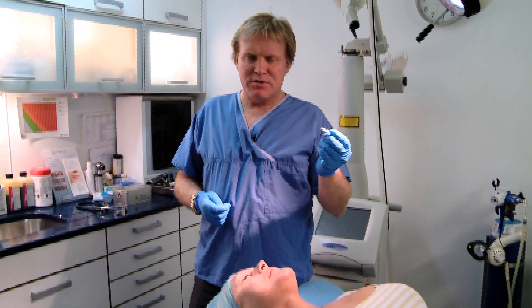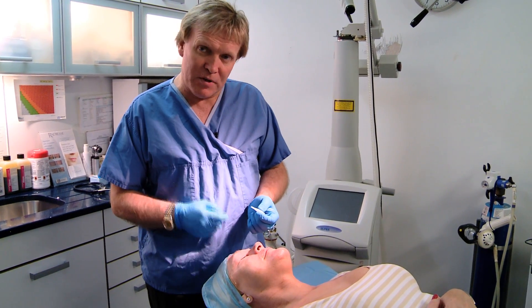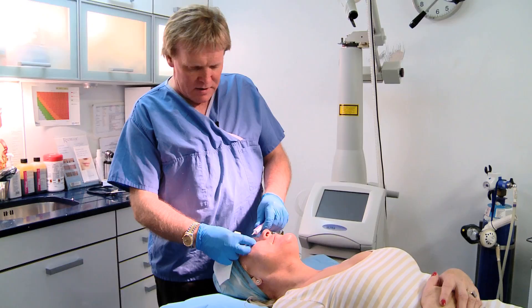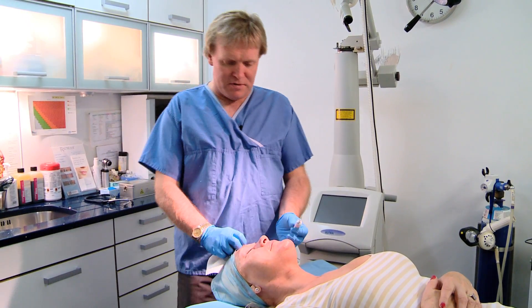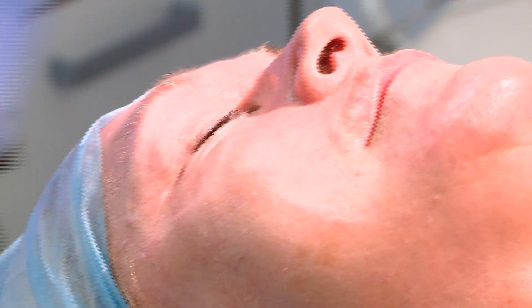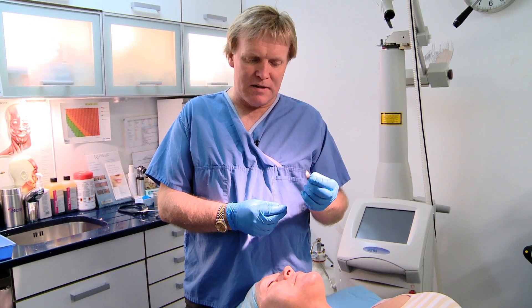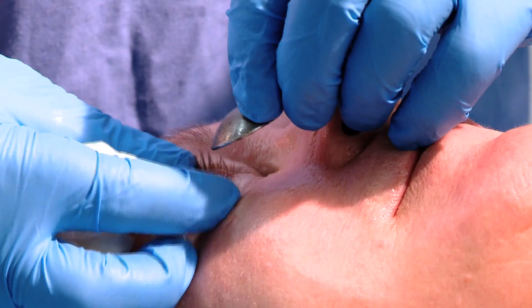The next stage involves using tetracaine 0.5% as a topical anesthesia for the eye. The patient may get a little sting from that for the first five seconds — I find that if you warn patients, they tend to feel a bigger sting than if you don't. Then we apply Bisane, which is a lubricant. Normally the patient won't feel this because they have anesthetic in the eye. For corneal shields, I find these ones preferable as they can be gripped from the outside, and I find them the easiest to use.